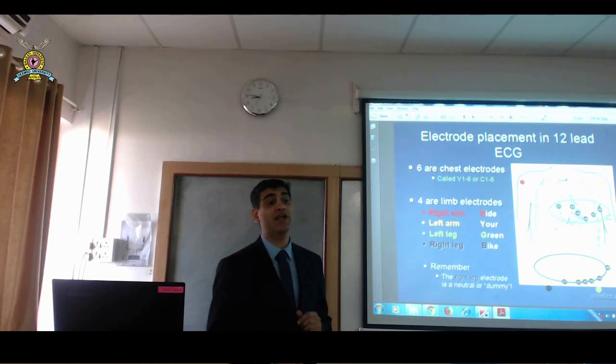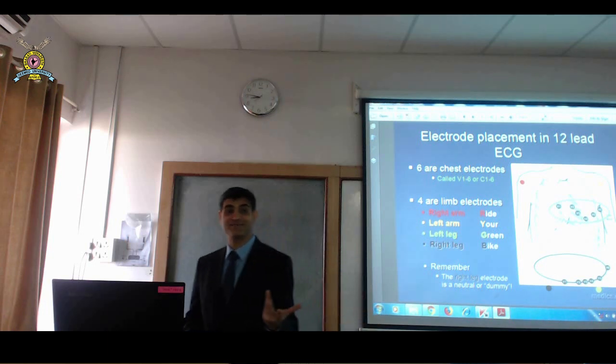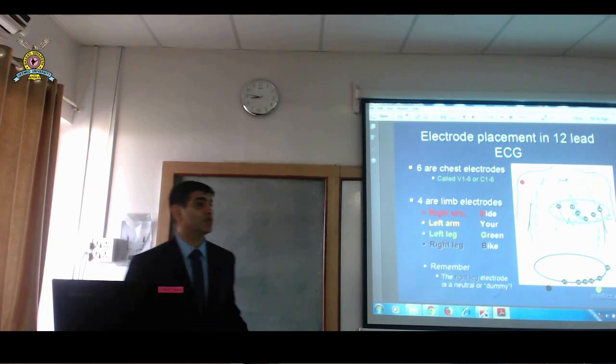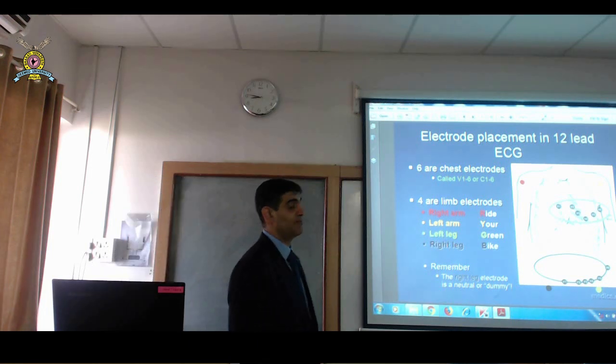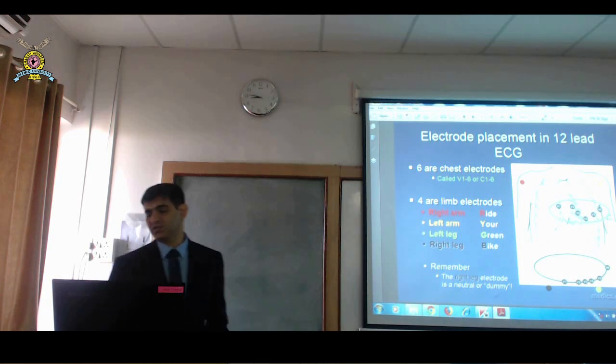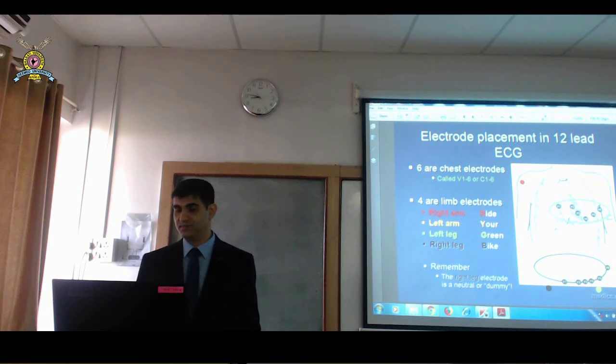So we always use bony landmark. Somebody may have mastectomy done. The breast is not there. Then how do you decide which nipple? Where is the nipple? So nipple is not a landmark. So we always use the bony landmark. Right? The nipple is located there, but that cannot be used as a landmark. You're right.